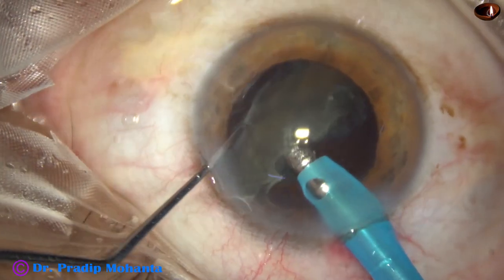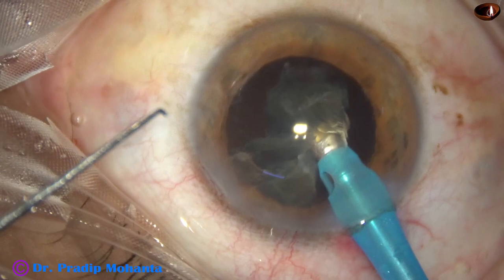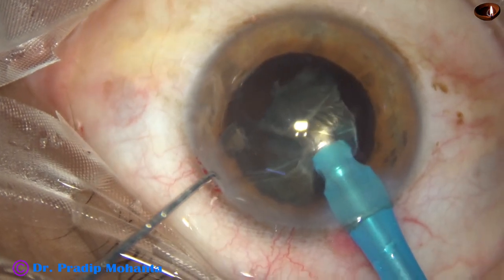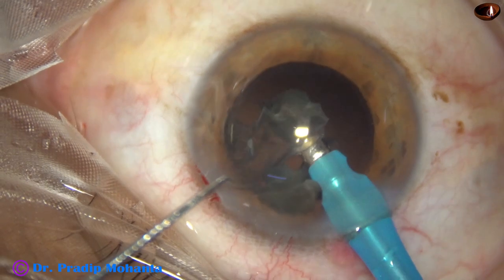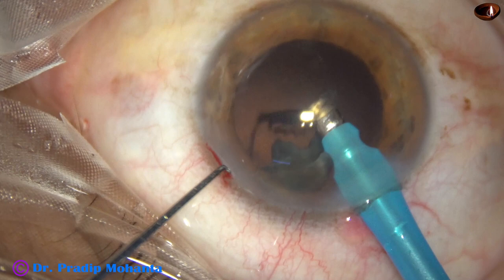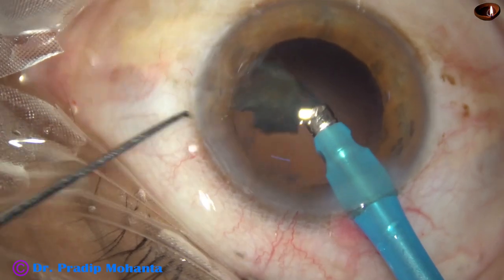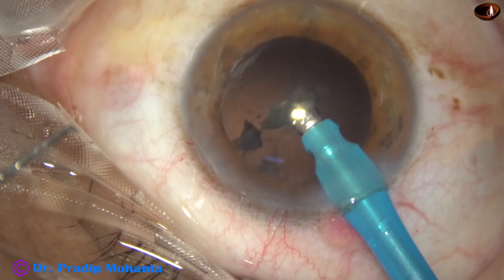This is a very leathery cataract with very sticky material — it does not tend to divide into pieces. This is diabetic cataract: the lens fibers become very sticky and very difficult to crack. The pre-chopper helps greatly in such cases. The pre-chopper used here has been designed by Dr. Sohail Irfan Khan of Nanded, Maharashtra, India — a nice device for such cataracts.